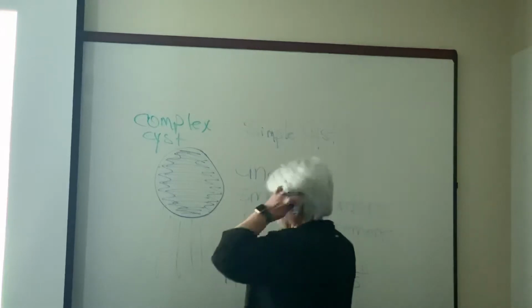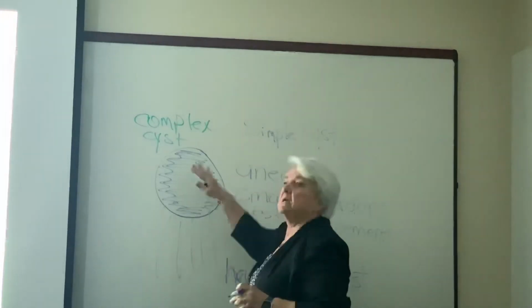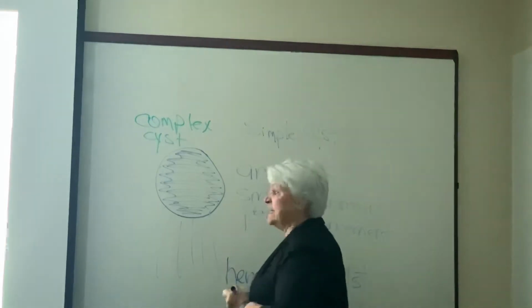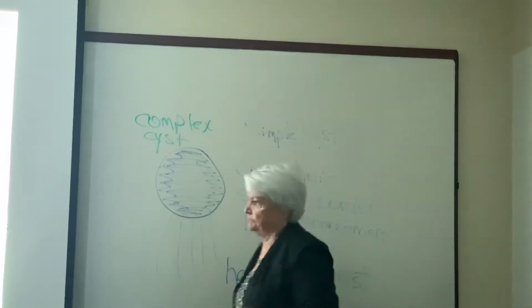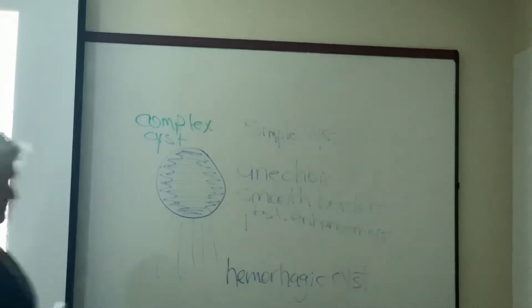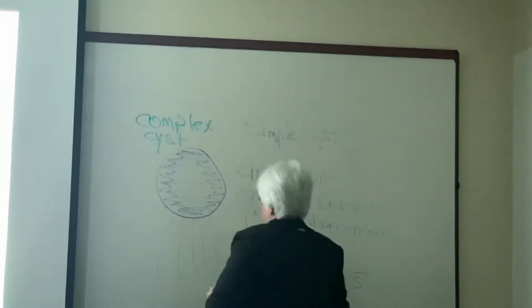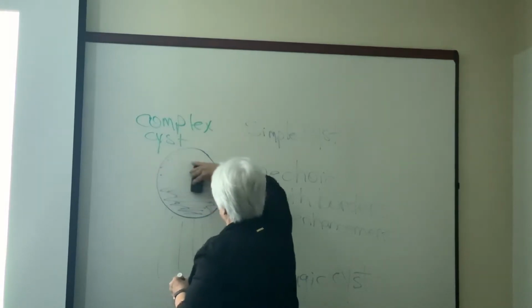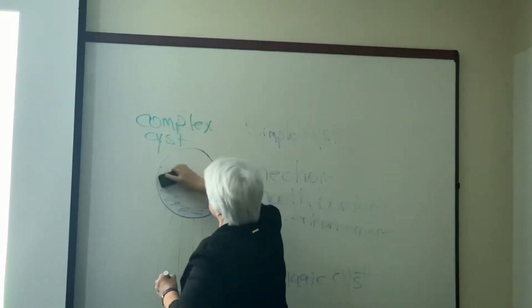Now, my hemorrhagic cyst, that blood is settling down. It's getting old. So it's layering out. I can actually see where the blood stops.